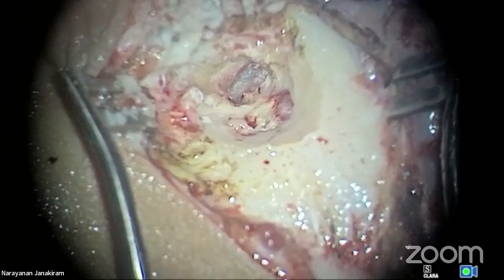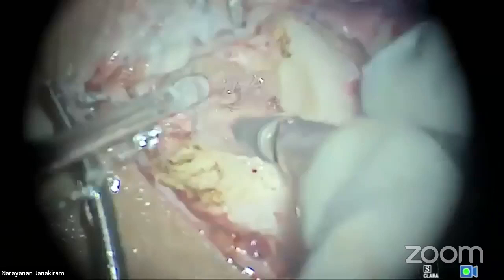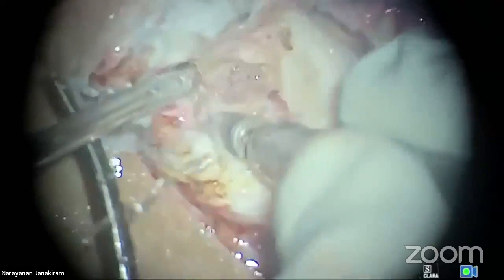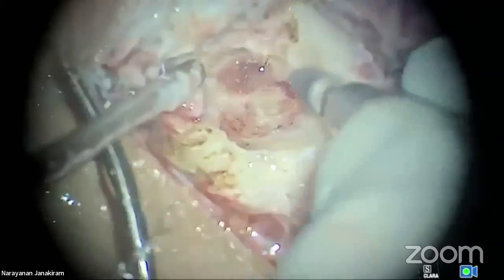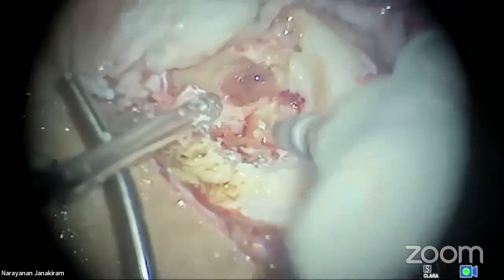See, don't do anything to the cholesteatoma. Just keep doing the C technique. See that. See how the cholesteatoma is going till the level of the tip cells. Can you see? Don't jump for the cholesteatoma now. You understand? That's a cavity which we saw in the scan, very clearly seen here as well.